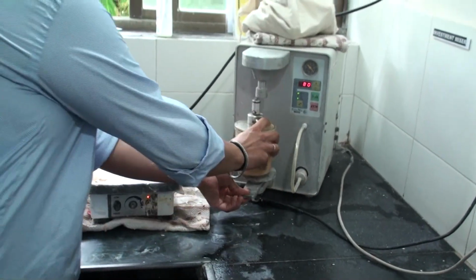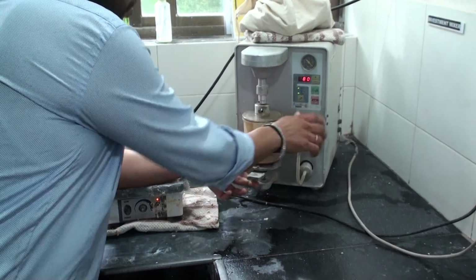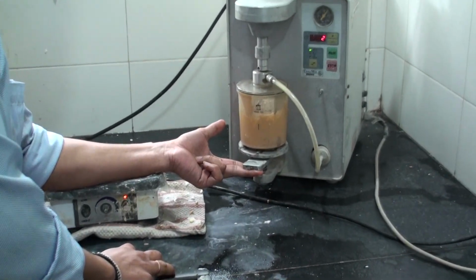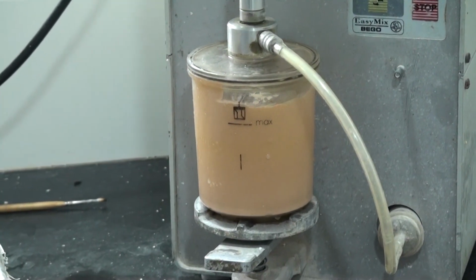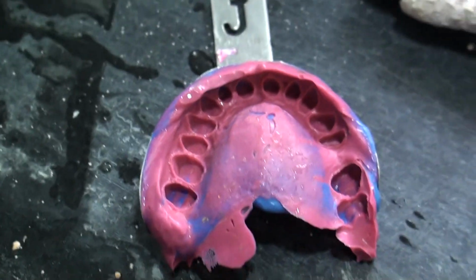This was interesting when I saw it because once you put it in the machine, he takes this little tube, puts it out of the machine, and what it does is it basically pulls out all the air from that chamber, and the stone plaster is mixed under vacuum, so you don't get any air bubbles. You get a very smooth consistency.